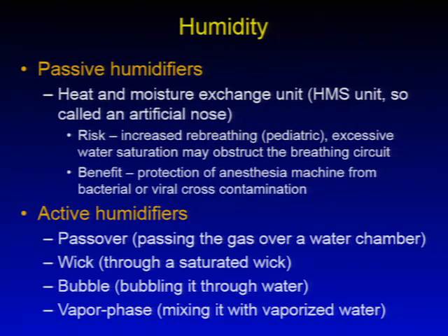In order to prevent that from happening, you have to provide humidity. There are 2 ways to do it. One is passive humidifiers, and the other one is active humidifiers. Passive humidifiers are basically the mechanical nose, the artificial nose, and that's called the heat and moisture exchange unit.